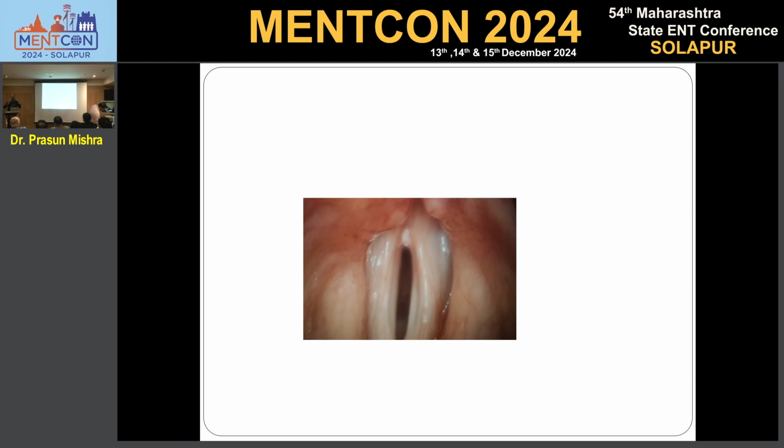For this, sir, the patient may bite it. We don't want to lose the scope. When you pass it from the nose, it's like a gastroscope. When you pass it from the mouth, you will immediately reach the larynx. In newborns, we do it when a case of laryngomalacia comes where the nose is very small. We put it from the mouth because they don't have teeth.